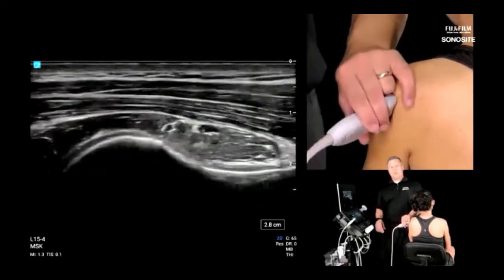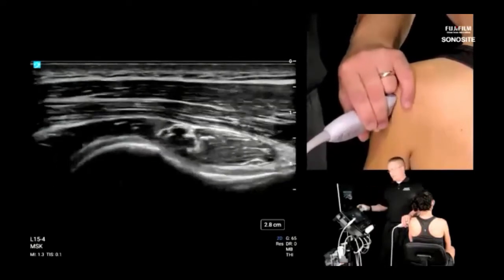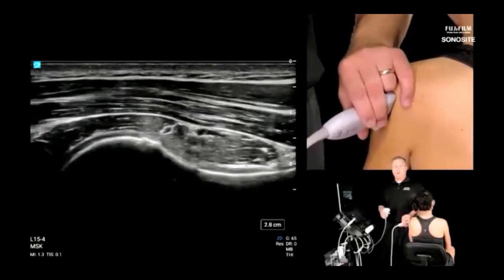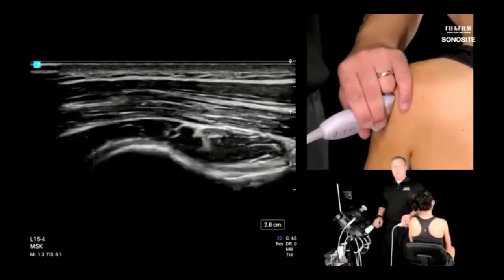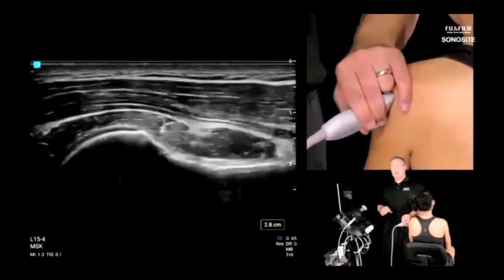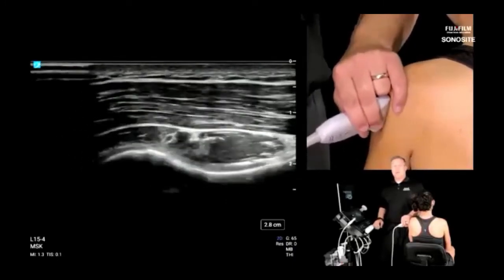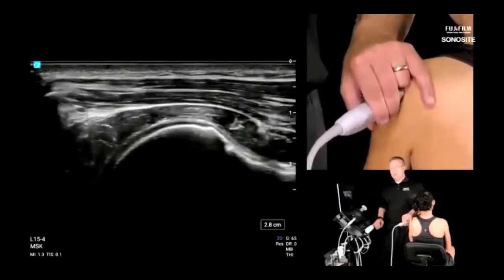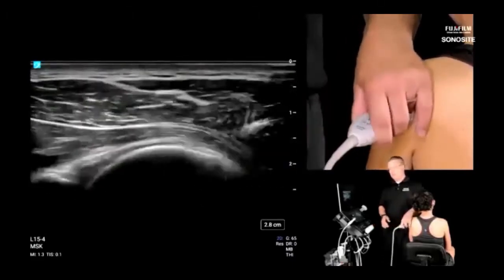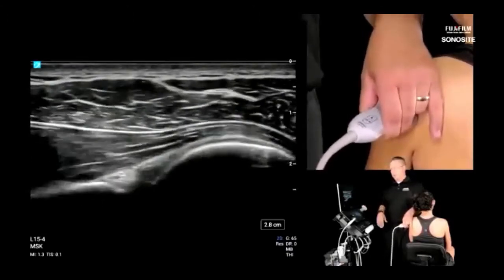Once the shoulders, and not to be insulting to people, I say once they get bigger than my shoulder, you may want to switch over to a curvilinear probe when you go past 4 or 5 centimeters. Then they start to get a little deep and a little hard and out of reach for a linear array transducer. But I would say in most cases for the posterior shoulder, you're going to be around 3 or 4 centimeters to see the structures that you need to see with confidence. At boot up, you can see most of the shoulder here at 1 inch.